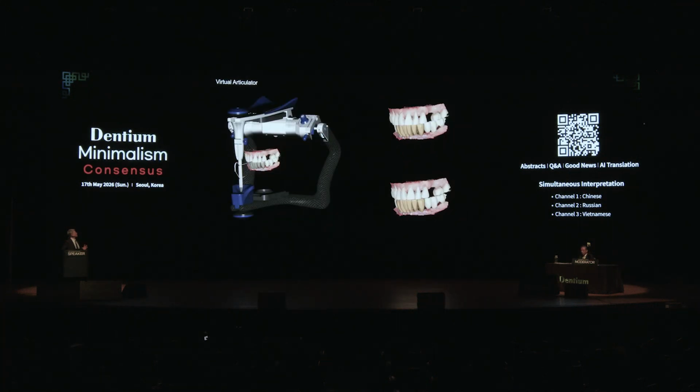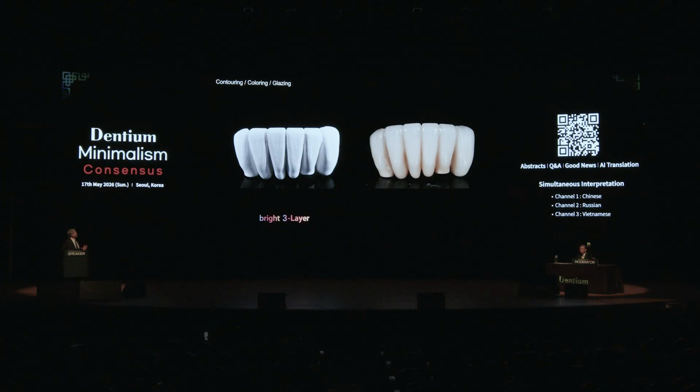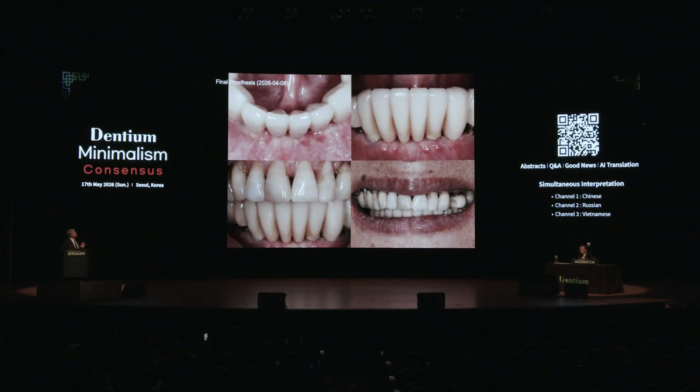Also in the virtual articulating, in centric and eccentric, and the finishing, we selected three-layer zirconia blocks, so without any coloring and staining, we finished and placed it into the mouth. The final process was done around one month ago.